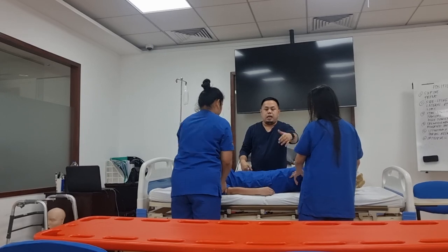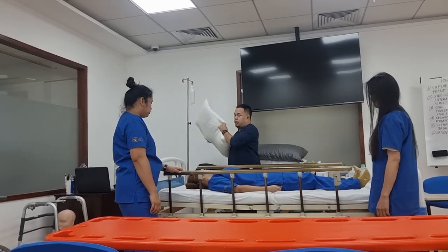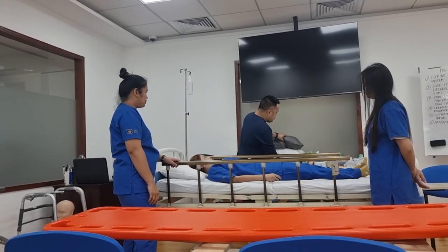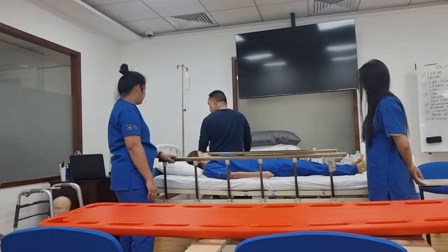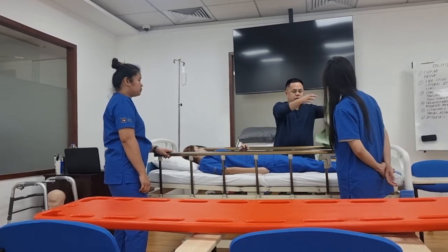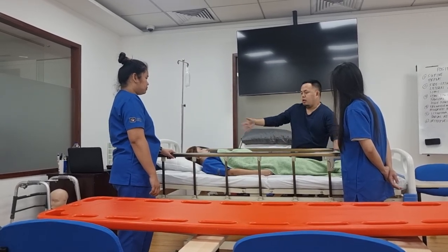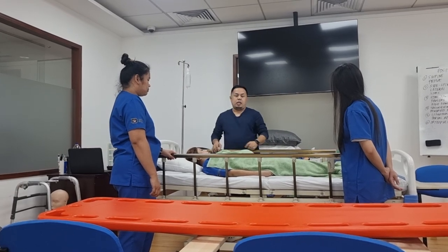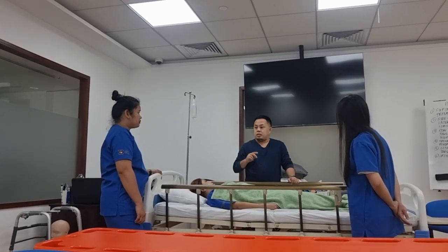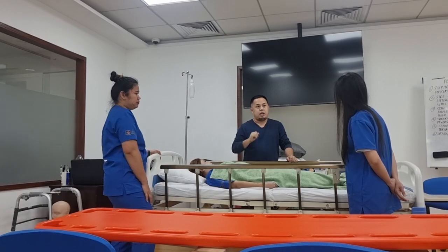Put the patient back to the center, then provide safety by putting the rails up. Take the pillow to provide comfort, and get a blanket — because you are taking the patient out, make sure you are providing privacy by covering the patient with a blanket. Then unlock the wheels of the stretcher bed and inform the patient: 'Ma'am, we're now taking you to your MRI examination.'